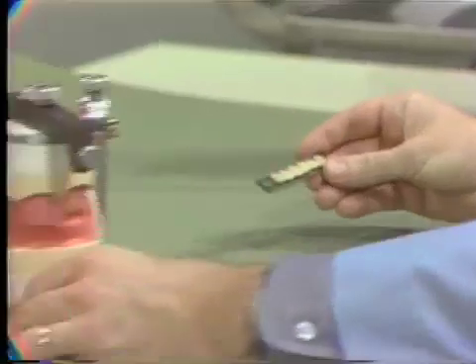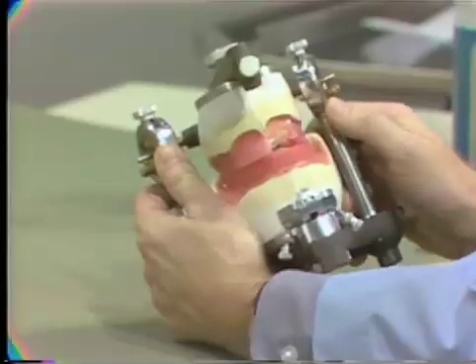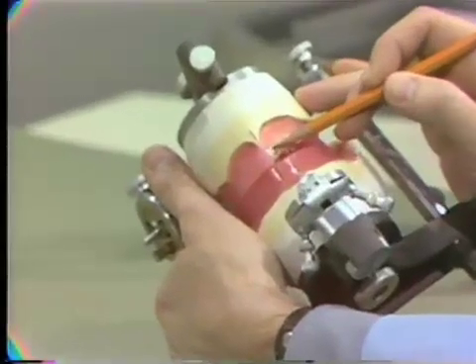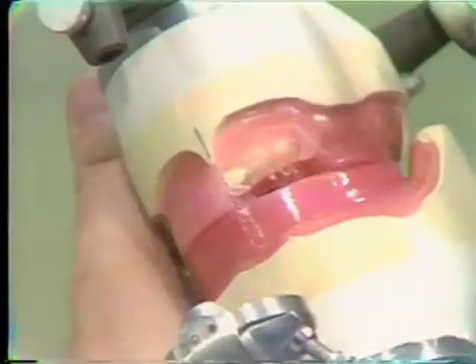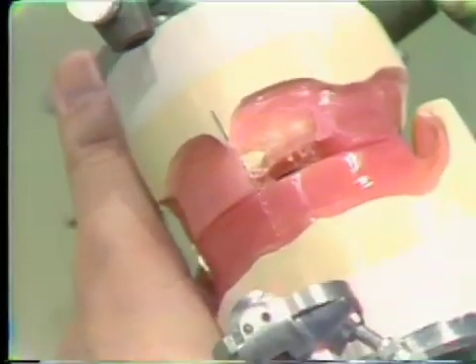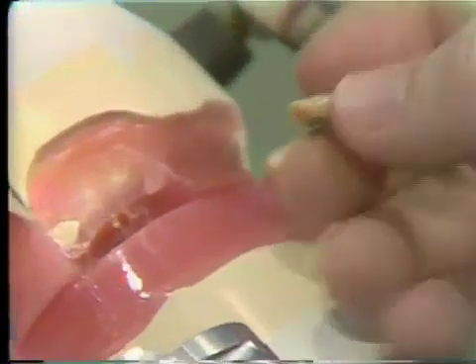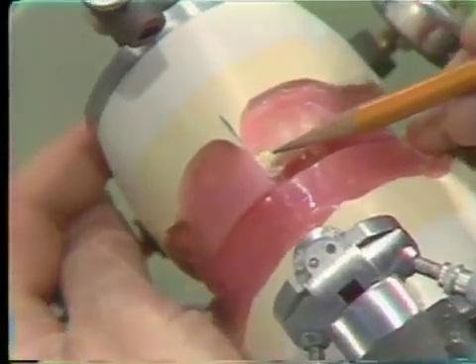Now the first step in actually setting the teeth will be to set the central incisor. And as you might have noticed, when I was removing the wax, I had a very thin area on the base plate. As a matter of fact, one area had actually broken through to the cast itself. Now it's important, as you remember, not to mar or scratch this cast in any way. But in this technique case, we have found that it is a good guide. Everybody will have the same setting if the small pins on the back of the tooth actually rest against the stone or close to the stone of the master cast.